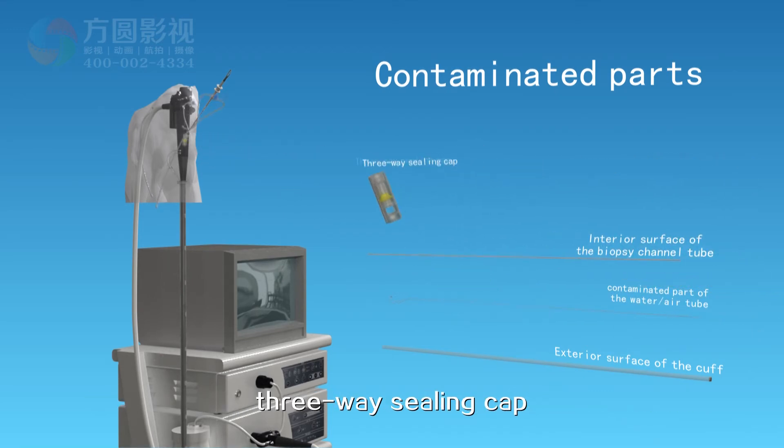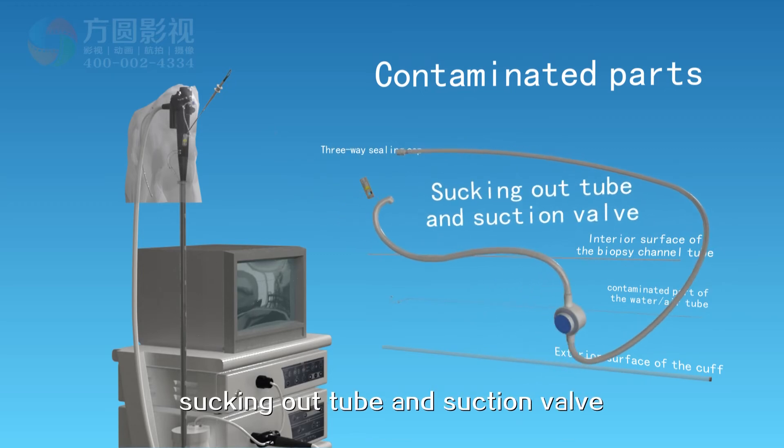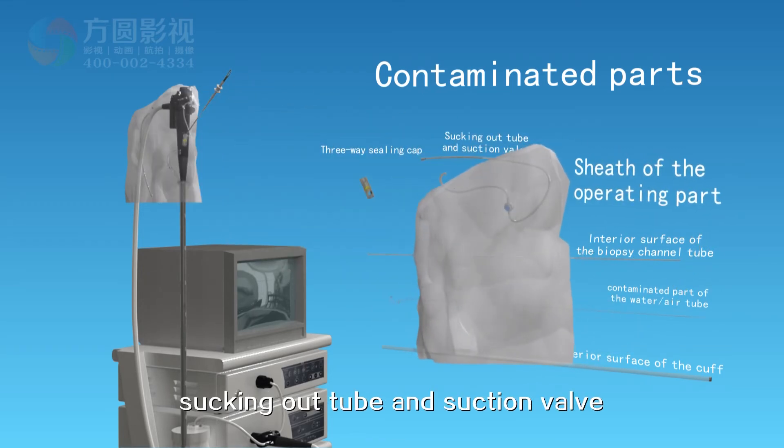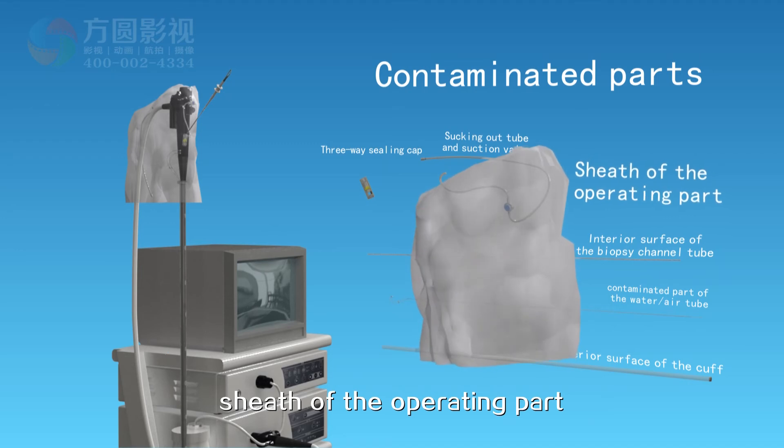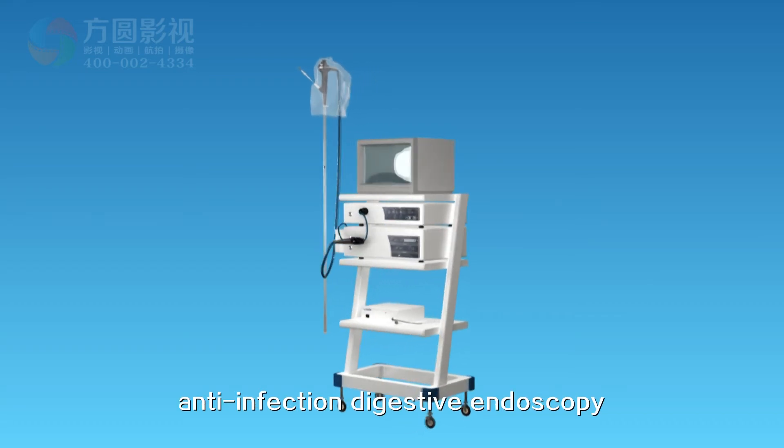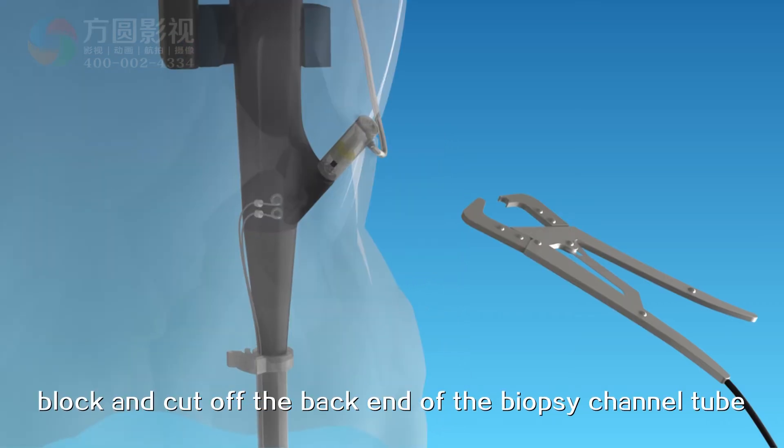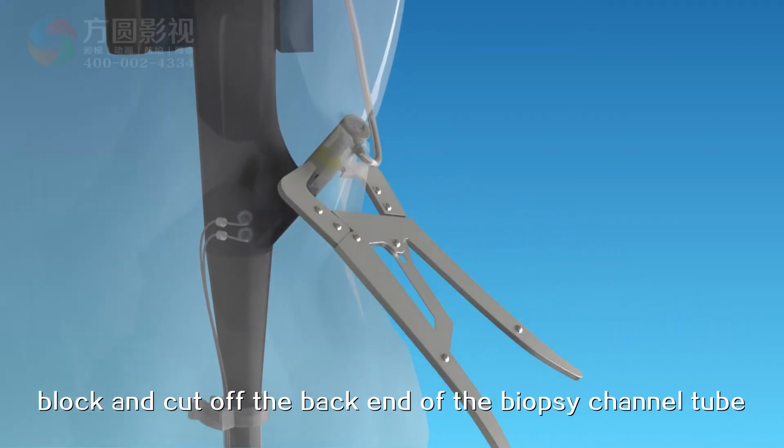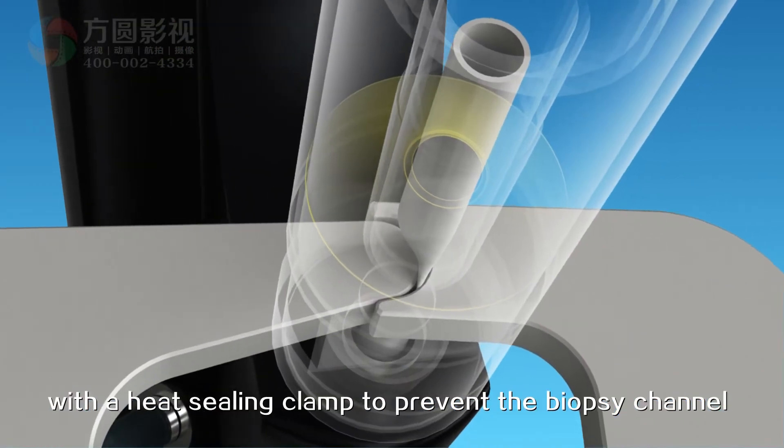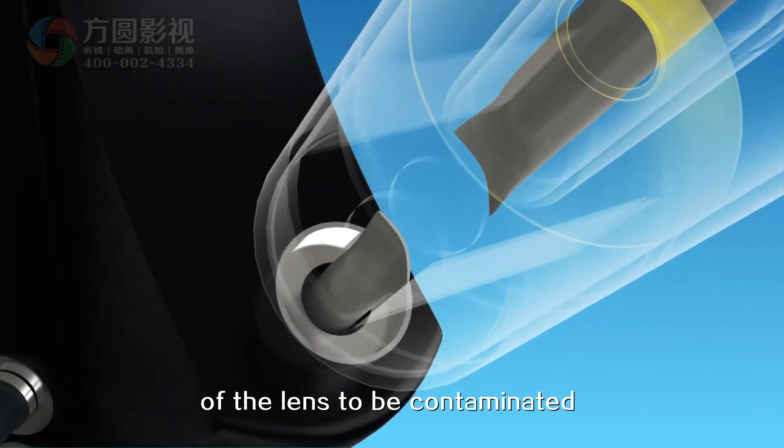Other contaminated parts include the three-way sealant tube, three-way sealing cap, sucking out tube and suction valve, and sheath of the operating part. Before dismantling the portable anti-infection digestive endoscopy, cut off the back end of the biopsy channel tube at the sealing position below the three-way sealant cap with a heat sealing clamp to prevent the biopsy channel of the lens from being contaminated.